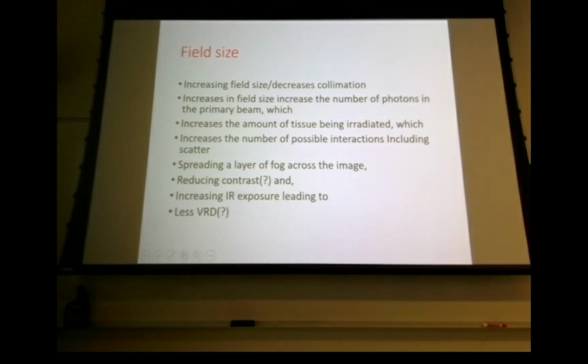So with an increase in field size, at your image receptor exposure, you might see a change in your index number. But as far as density goes, it's again going to be controlled by your computer algorithm. So it wouldn't do much to your visibility. It really doesn't.